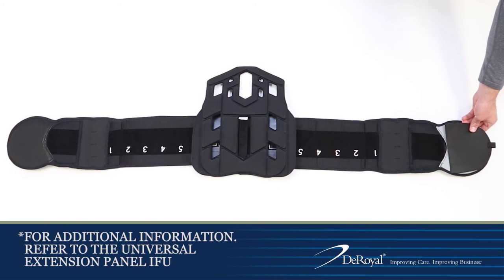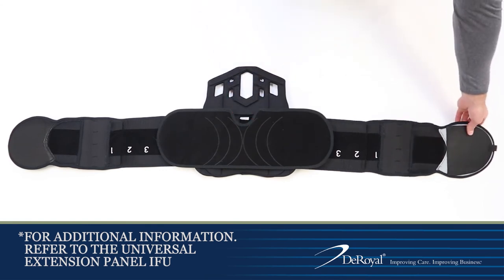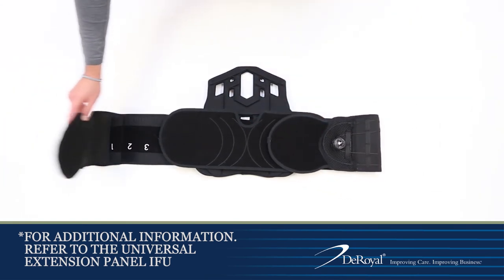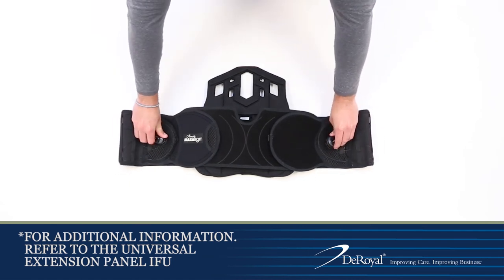Remove the double-sided hook from the extension panel and place it on the gray loop of the left belt arm. Secure each belt arm to the appropriate zone on the extension panel. Push in the BOA dials and turn clockwise to provide compression.